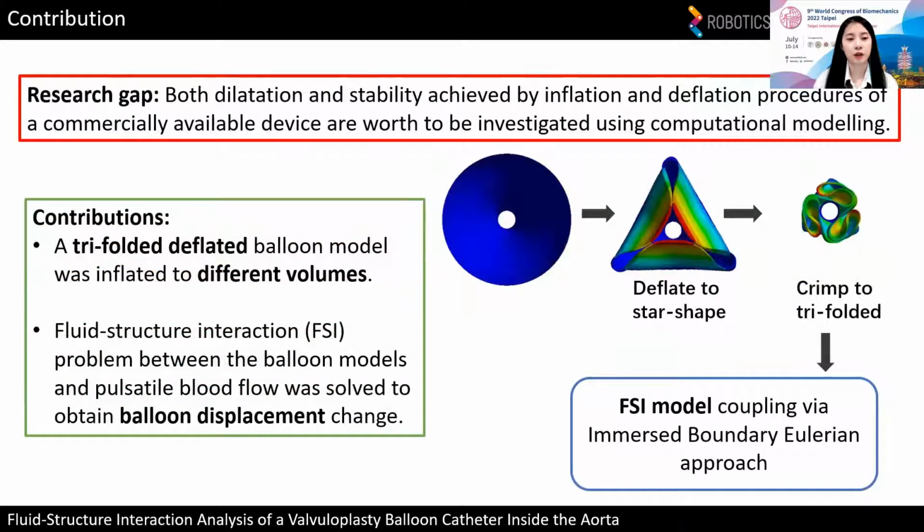So there are two contributions in this abstract. A three-folded deflated balloon was created to obtain the balloon models with different volumes inside. Here is the balloon deflated to the three-folded configuration. Another one is solving the fluid structure interaction problem to know the balloon vertical displacement changing along the aorta, where the FSI model is coupled via an immersed boundary approach.